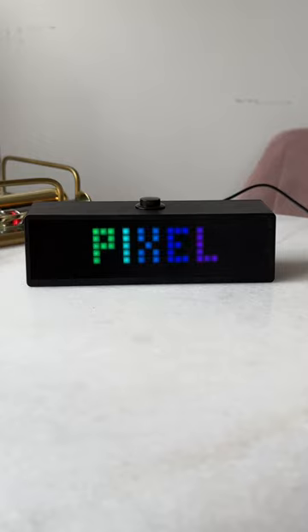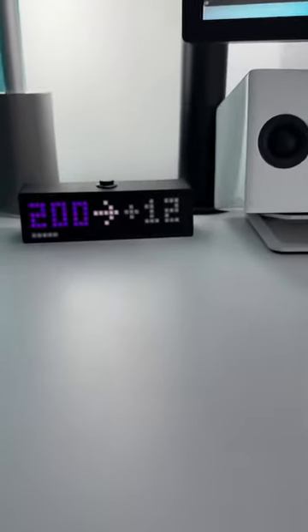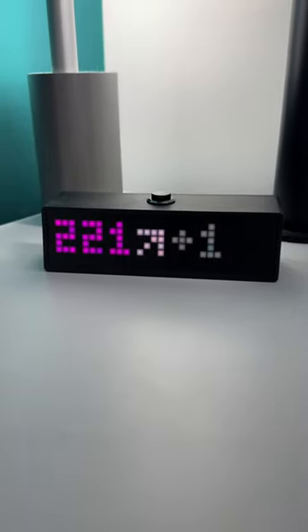This device can display your blood sugar levels, and it has an optional alarm system. Sugar Pixel updates every five minutes with my glucose readings. The color of the number is based on sugar level.